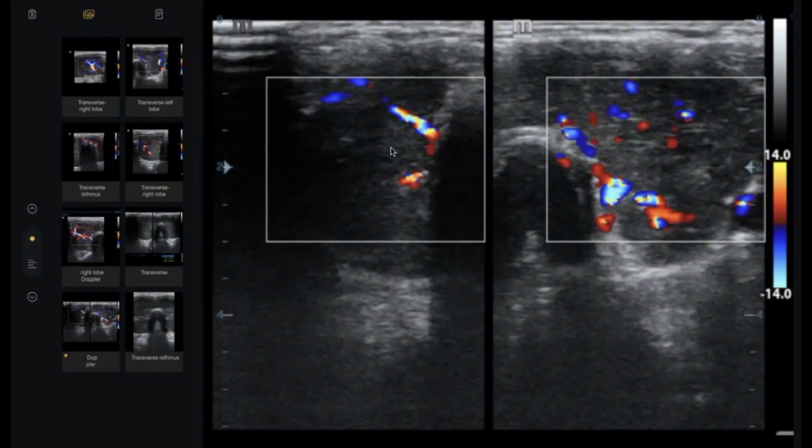Anyway, this is not important, but I'm trying to give you as much as possible a typical question. LATS. Okay. See, this is thyroiditis. Thyroiditis may be a part of IgG4. I agree with you. And the orbitopathy also may be a part of IgG4, but not related to thyroiditis, related to pseudotumor.